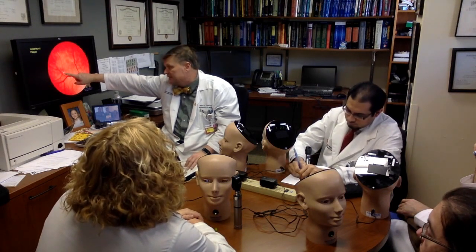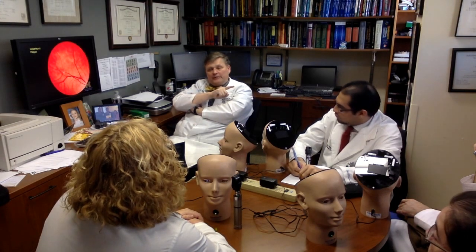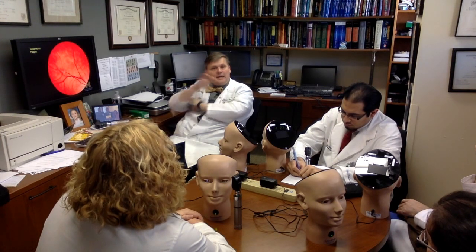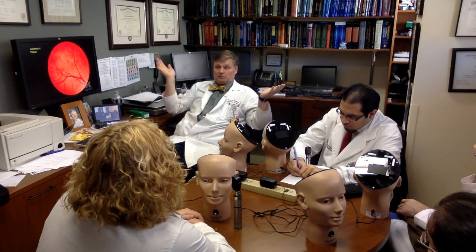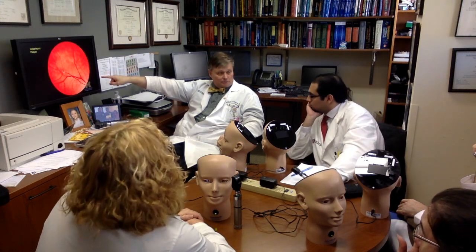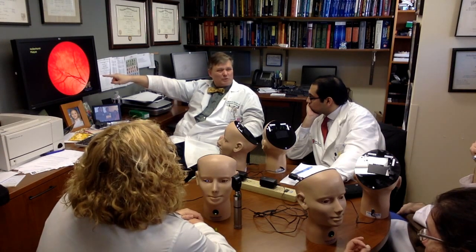Now, why is this one so important? Because let's say the patient comes to you with a spell and says, last week I had this thing where I just couldn't get my words out. I knew what I wanted to say, I just couldn't come up with the word I wanted to say, and it lasted like 5 minutes and went away. Their exam's totally normal. But you look in their eye and you see this. That makes you think, they must have carotid disease. This really was a TIA. So that's why it's so important.